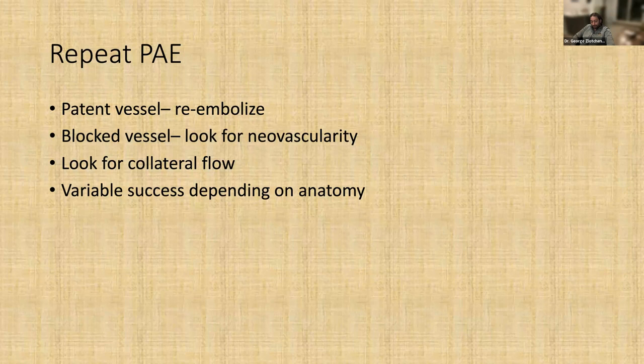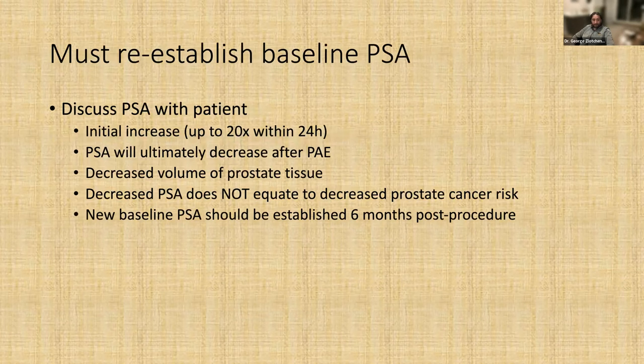So I say go for it if you have a patient that's complicated, like, for example, my Alzheimer's patient who may have other issues going on. It could be that there are other collaterals or neovascularity, or your vessel wasn't fully embolized. So, something to consider.